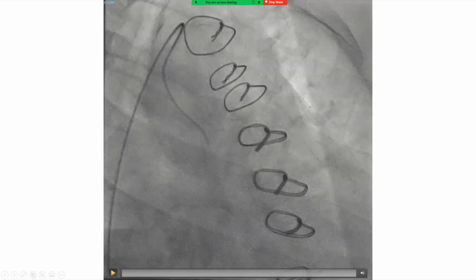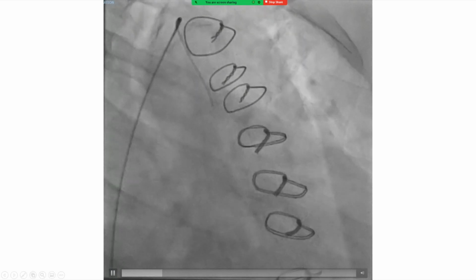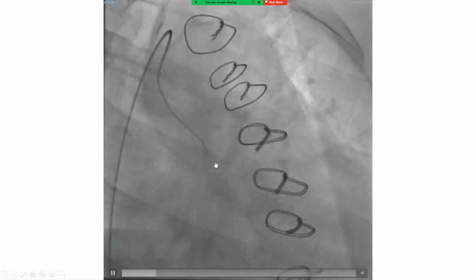This is an illustration of that. This is an Amplatz Left 2 engaging vein graft to diagonal. So again, you see at the beginning, it's elongated with a free tip. We're clocking here, trying to hook that ostium of the vein graft. We're trying.